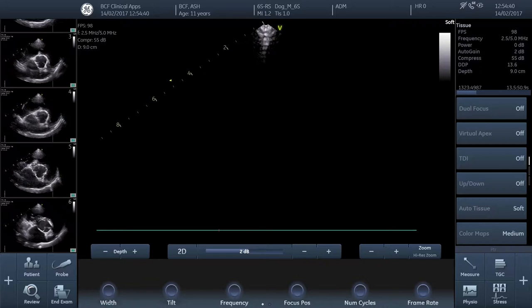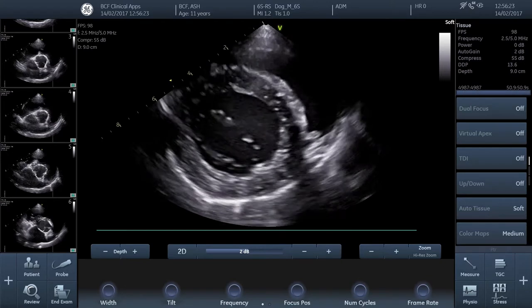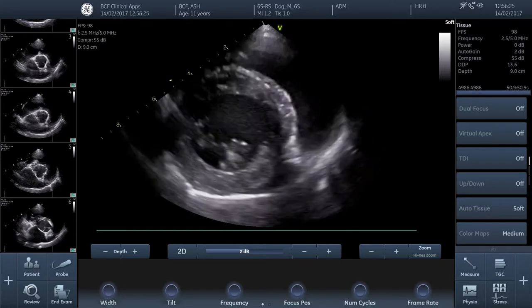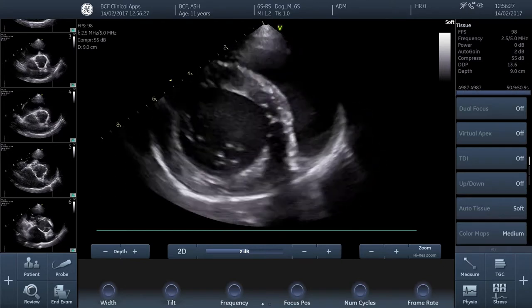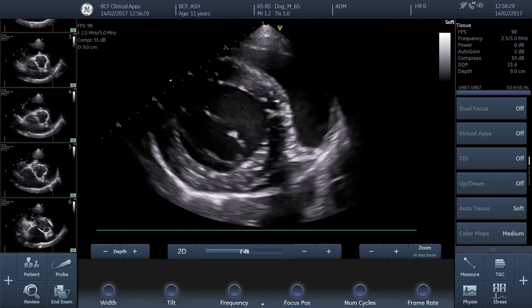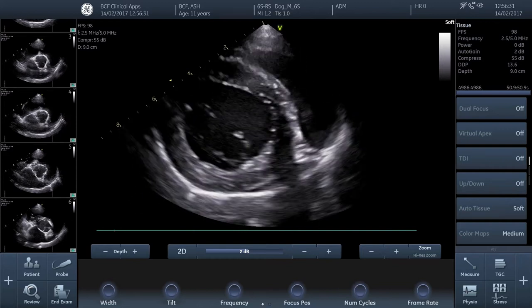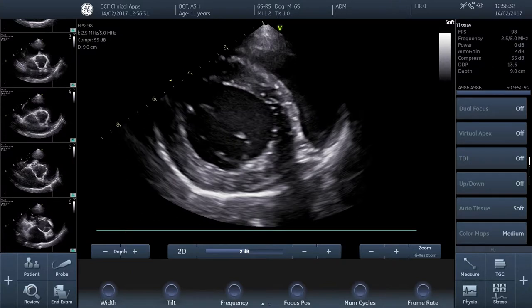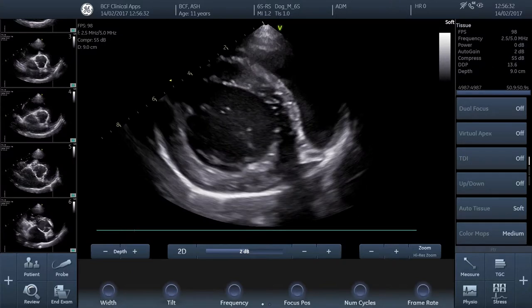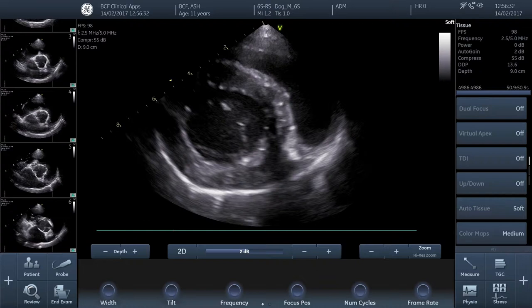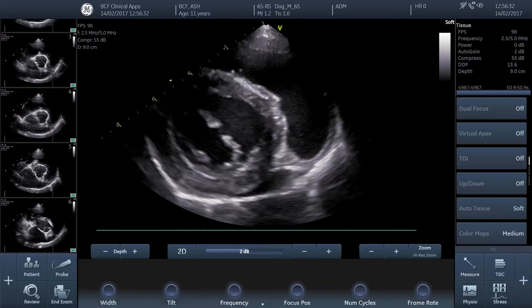The first thing we need to do to take this measurement is to acquire the appropriate view. What we're looking for is a nice cross section through the left and right ventricles, with the left ventricle appearing as circular as possible. We've got the interventricular septum in the middle, and we want to be able to see the mitral valve leaflets opening and closing throughout the cardiac cycle. They're sometimes described as having a fish mouth appearance, which gives this view its nickname of the fish mouth view.